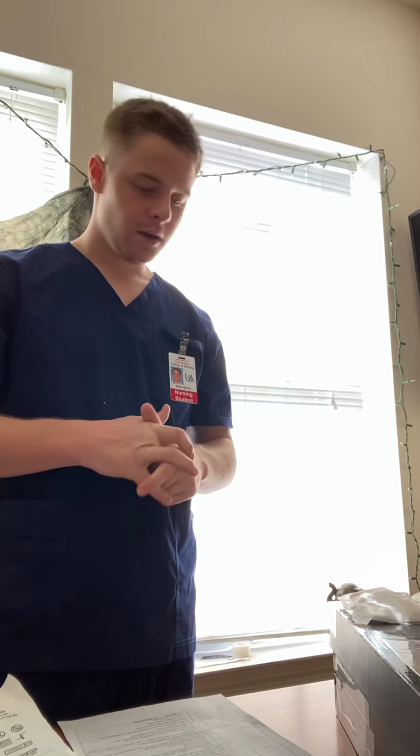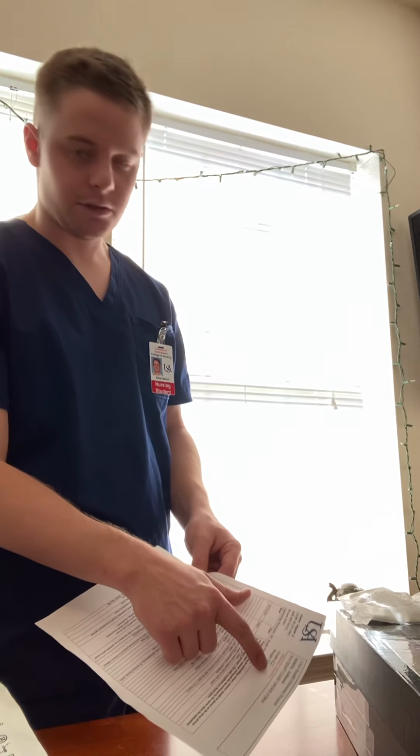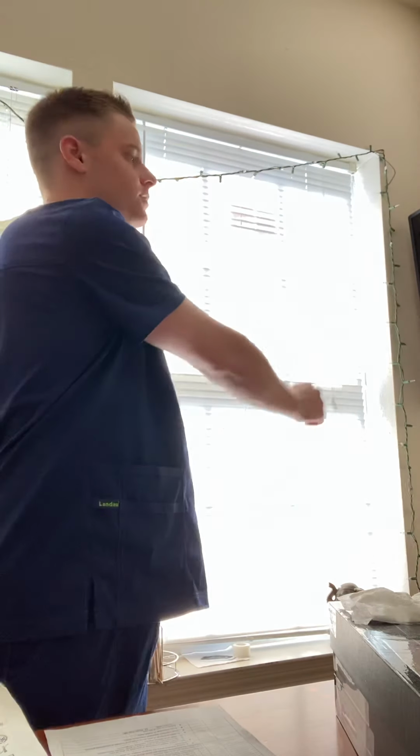After I've done that, Mr. Jones, today I'm going to be cleaning your central line dressing and putting a new dressing on. And then I make sure I have all my equipment gathered. I would also make sure that there's no allergies. I see that he has an allergy to penicillin on his patient care order form, and that is present on his armband as well. So after I've done that, provide privacy for Mr. Jones. I'm going to turn this box back like this and then move my camera.